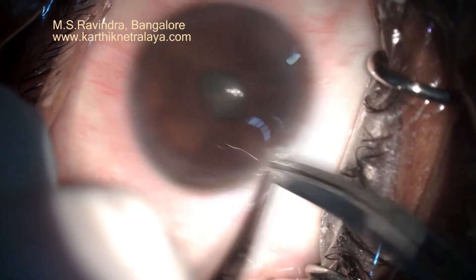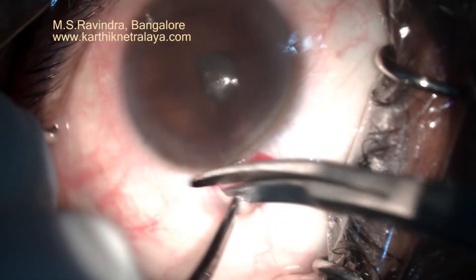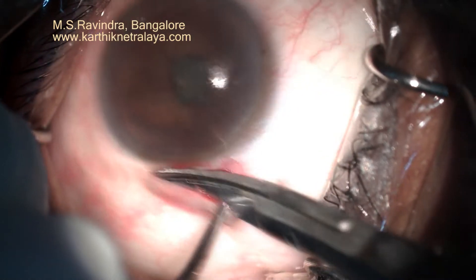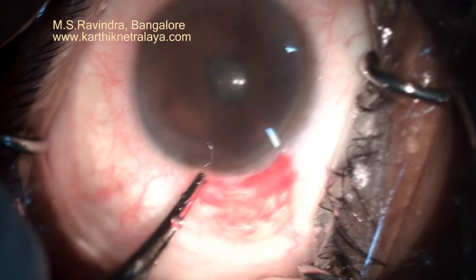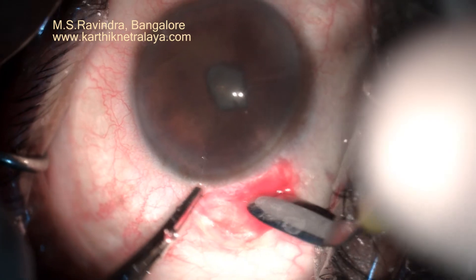Bilateral cataracts in a mid-aged lady with chronic uveitis. You see a small pupil which is bound to the lens with posterior synechiae, and there is a fibrotic ring at the pupil which restricts the dilatation process.